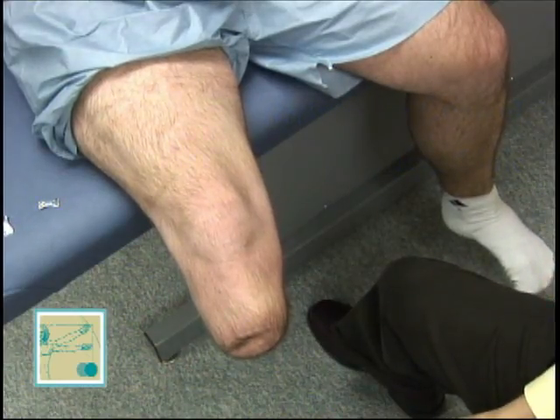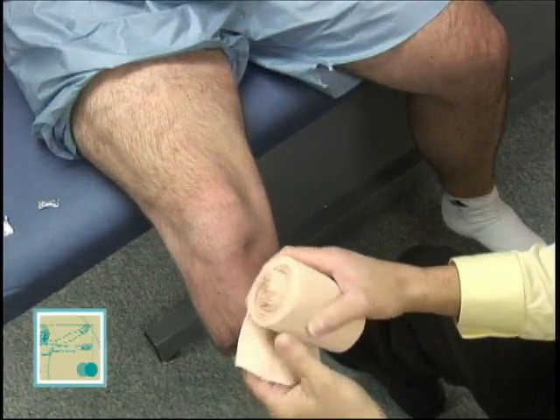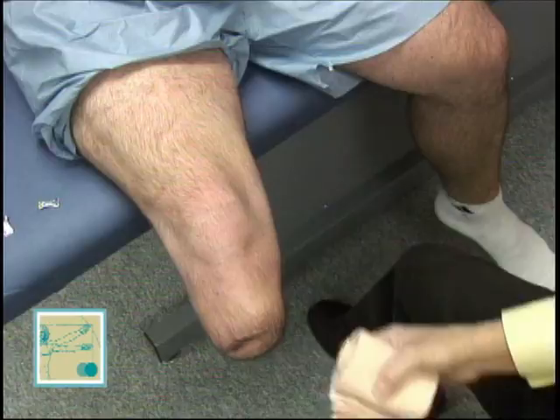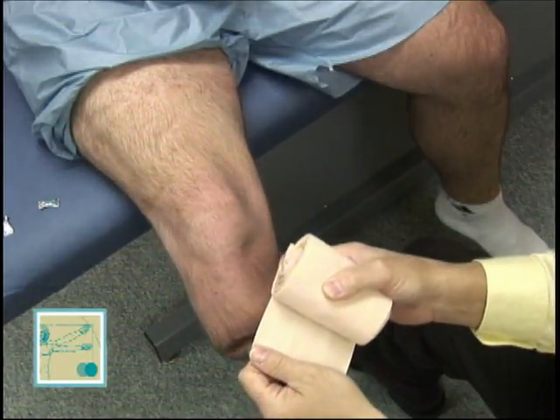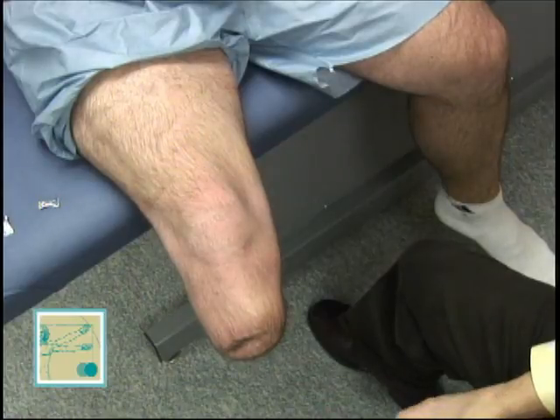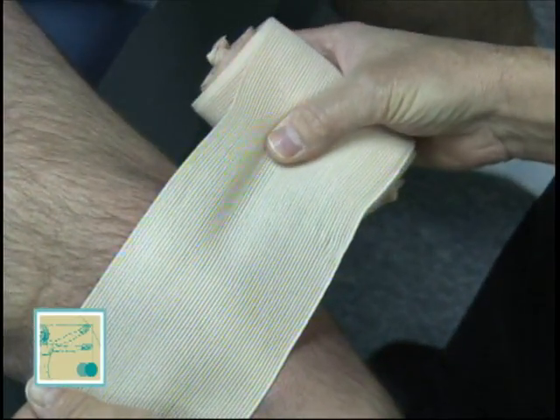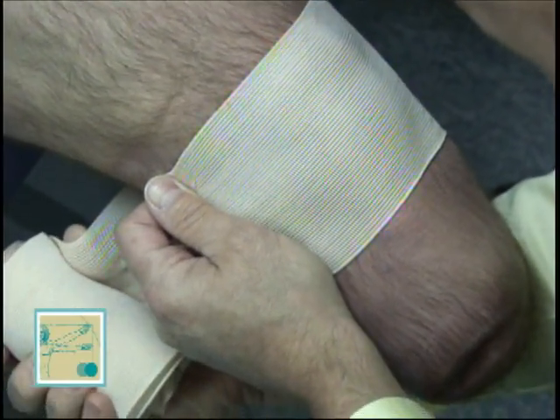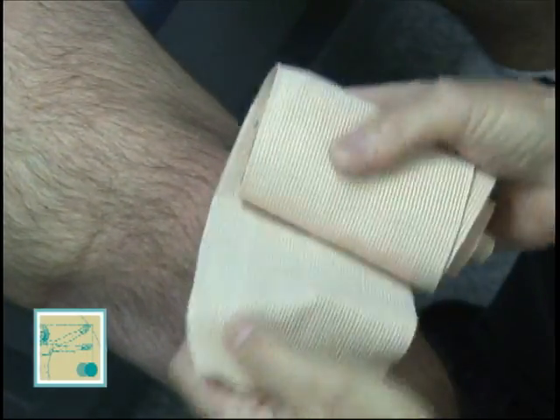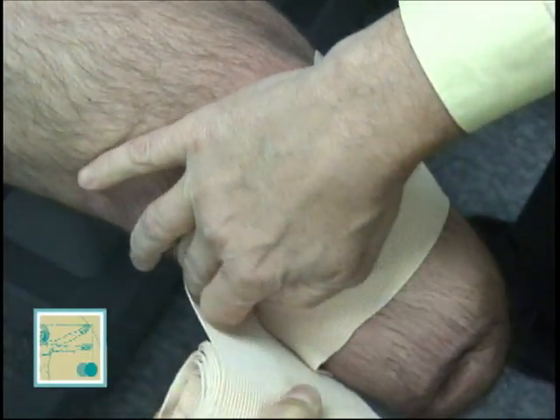So here's our first model, obviously a well-heeled transtibial amputee. Before we even begin to wrap his limb, I want to show you that I have two 4-inch ACE wraps that are sewn together. Even though his limb is fairly short, it's going to take two 4-inch ACE wraps to do that. I use a 4-inch ACE wrap instead of a 6-inch because a limb this size — if I use a 6-inch, I'm going to get all these dog ears towards the bottom of his limb and I don't want that. You don't want to have the wrap come off of your hand like this; it's just too hard to keep the tension even. It's a lot easier if it comes off like this — you can control the tension a lot better.